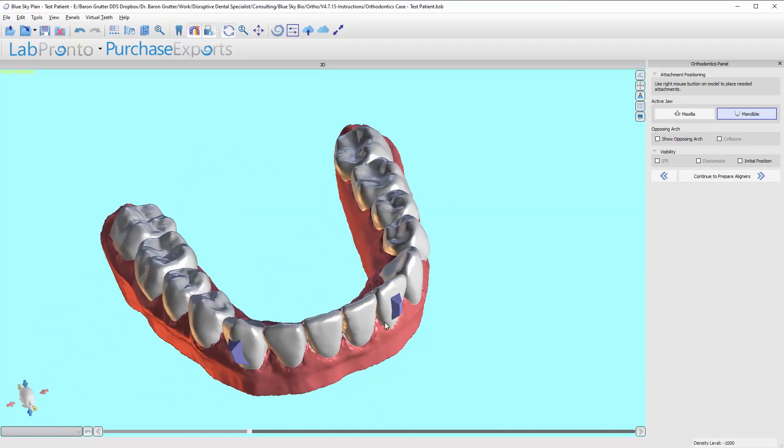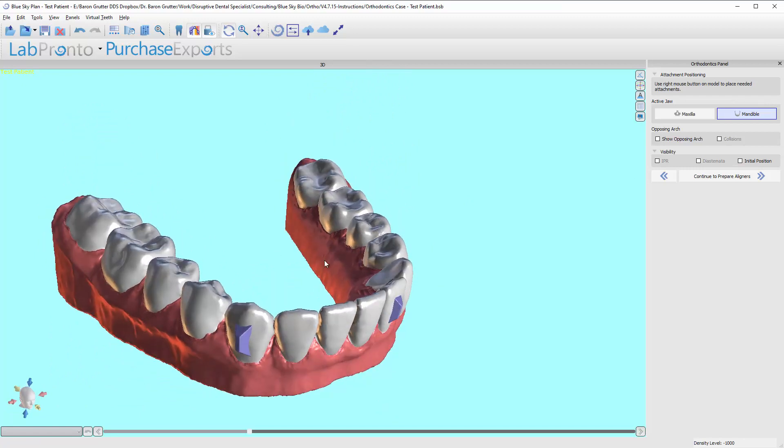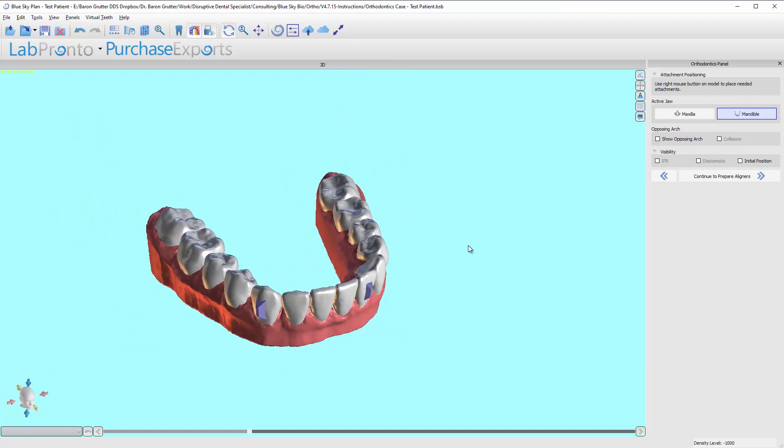Hide the initial, and this is what those are going to look like. So that's it. That is the adding buttons phase of this module. All right, I'm going to go ahead and press forward to continue to prepare the aligners.